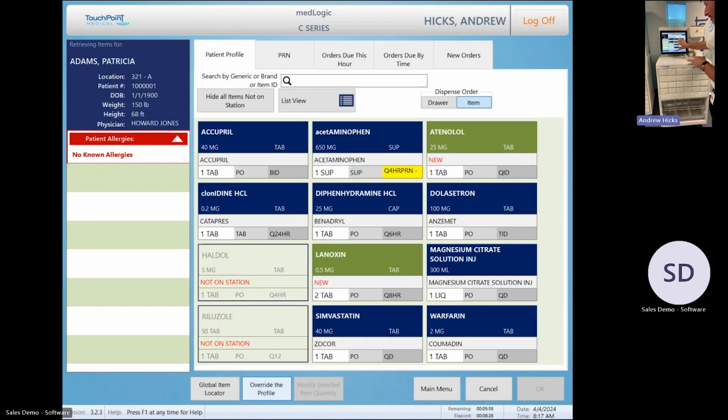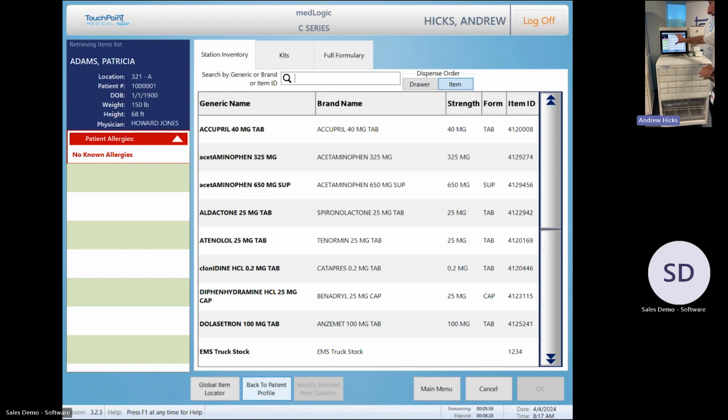The great thing about this is typically the view you are going to see either if you don't have an interface to your pharmacy software vendor, or if that particular machine in the hospital doesn't need an interface. For example, an ER machine typically doesn't have the profile interface, so it would default automatically to that screen with a listing of all the meds.